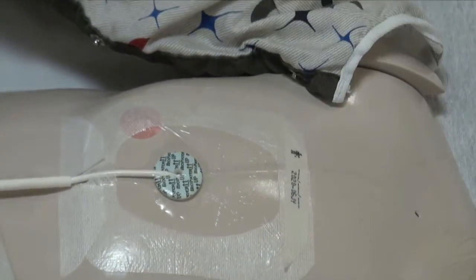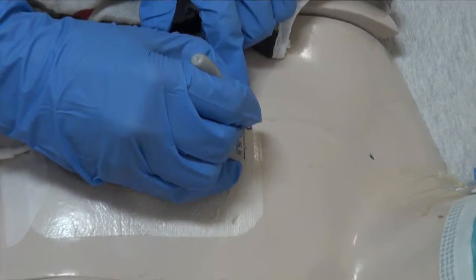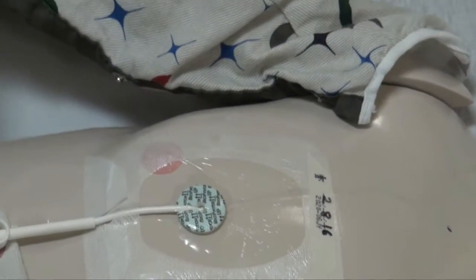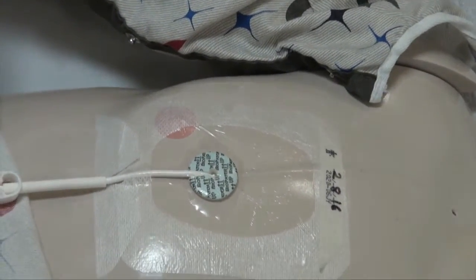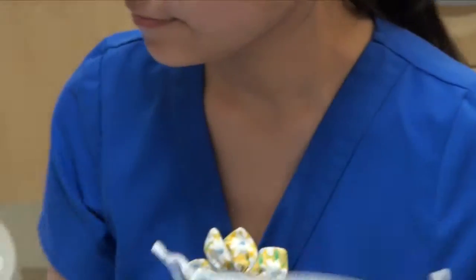You want to make sure to date the line so that you know when it has been changed. Remove gloves and face mask and discard all supplies. Dressing change has been completed.